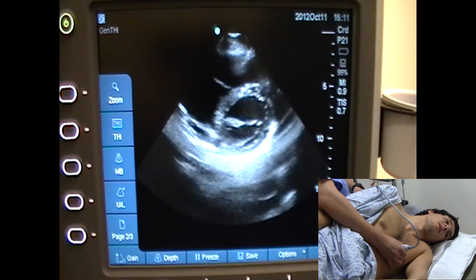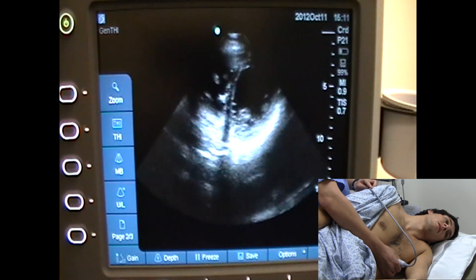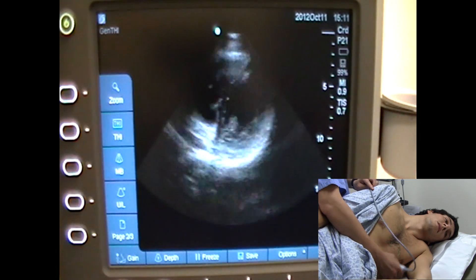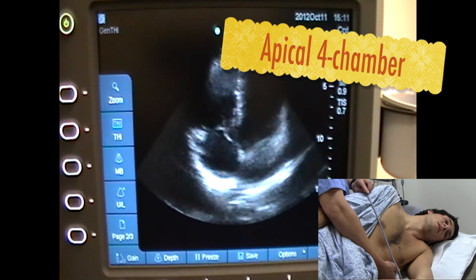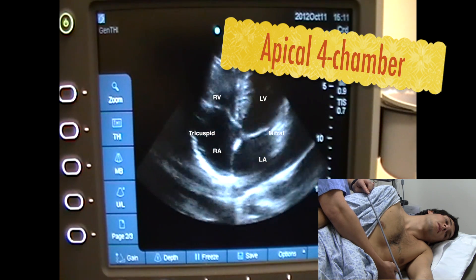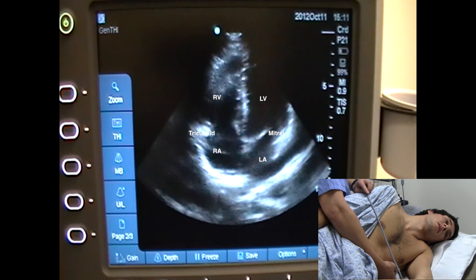How I like to find the PMI is by scanning on the short axis view, and I keep scanning down until I don't see heart anymore — that's where the apex is. Then I tilt down to get what we call the apical four-chamber view. In the apical four-chamber view, you have the left ventricle, right ventricle, left atrium, right atrium, mitral valve, and tricuspid valve.